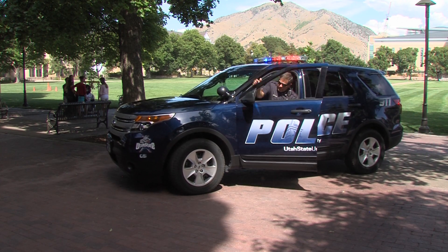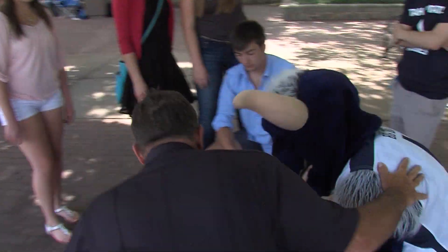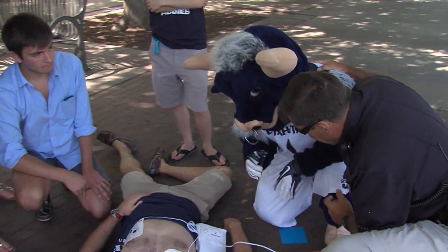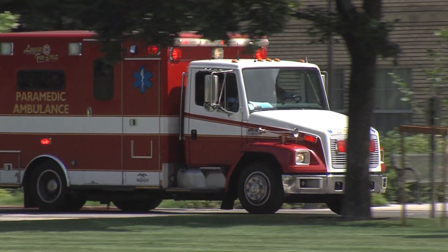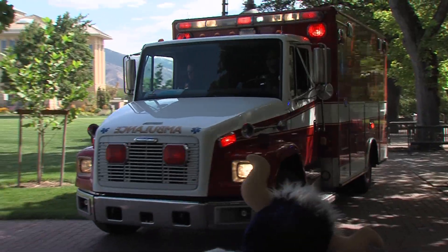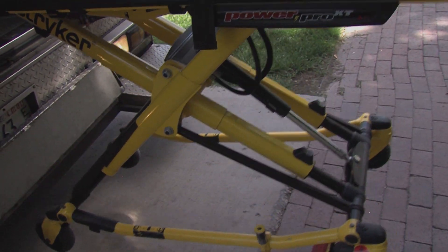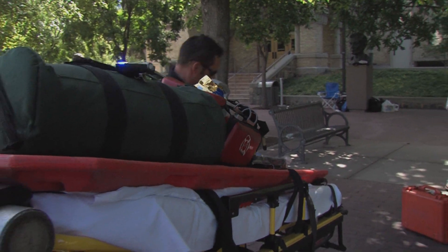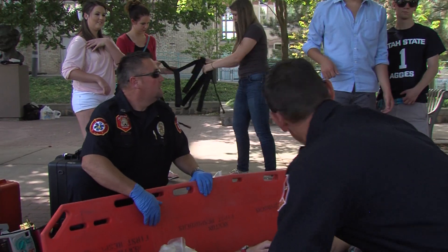Typically, campus police will arrive first. They will help guide in emergency medical services and will want to know as much as you can tell them about what happened. Having witnessed a full arrest and knowing that an AED was on scene and has been applied — that's good. Be prepared to follow their instructions and be as helpful as possible.